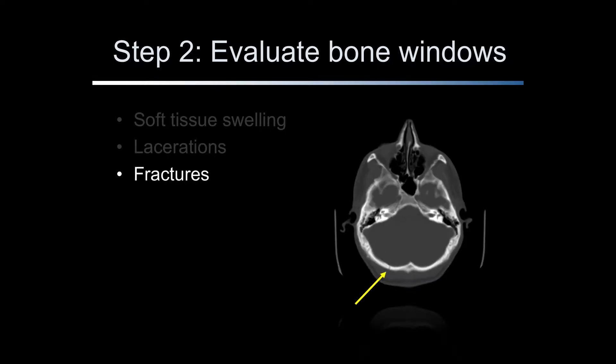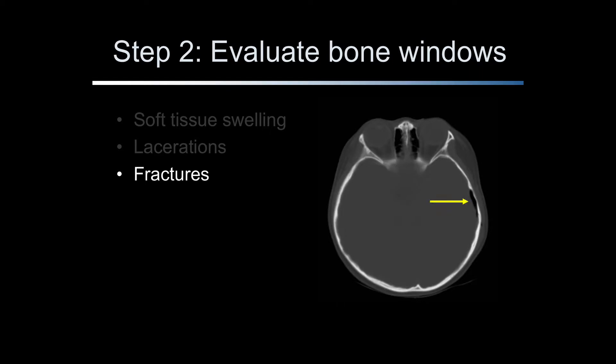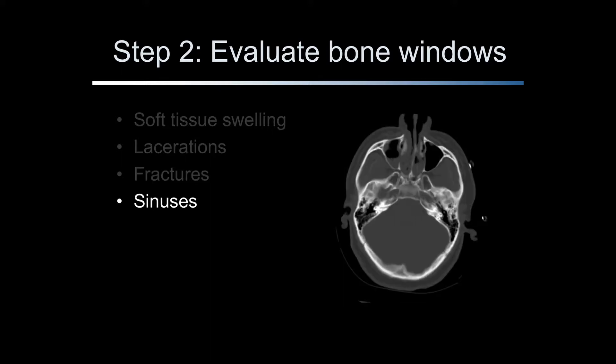Skull fractures are described as linear, basilar, depressed, diastatic, ballistic, open, or comminuted. The corresponding parenchyma windows should be carefully evaluated for hematoma, coup, and contra-coup injuries. Pneumocephalus may be seen in patients with lacerations overlying a skull fracture or fractures involving the inner table of the frontal sinus. Pneumocephalus is best seen on bone windows. Air collections, such as sinus air or intracranial air, are best seen on the bone windows. Mucosal thickening and an air-fluid level are seen in the right maxillary sinus. The bone windows offer an excellent look at paranasal sinuses and mastoid air cells.